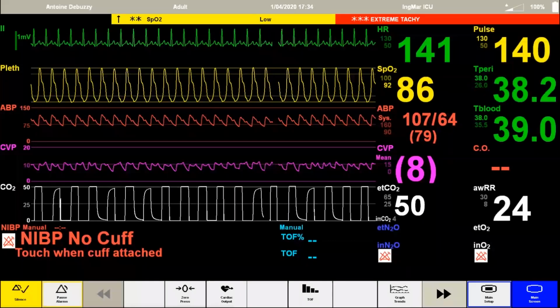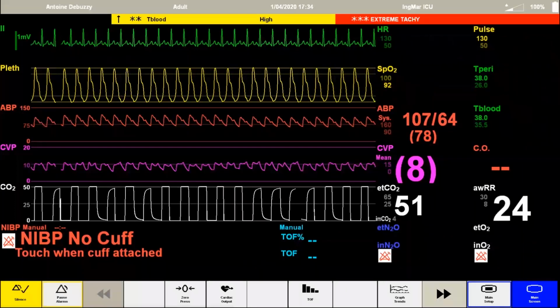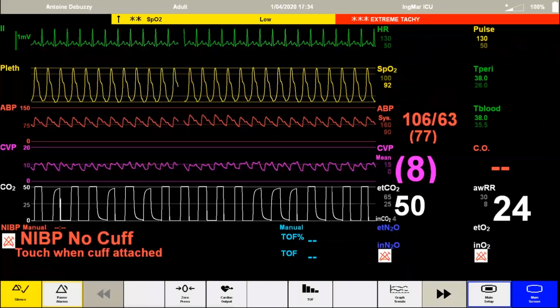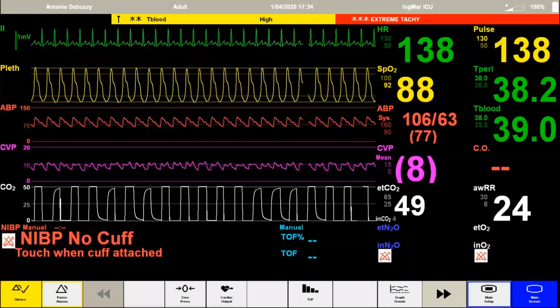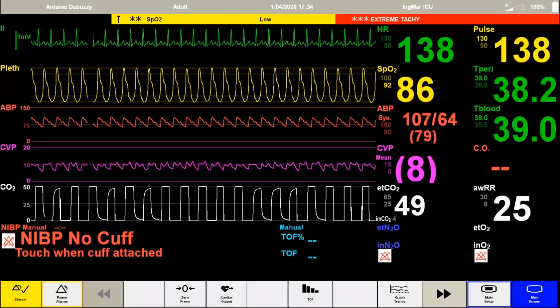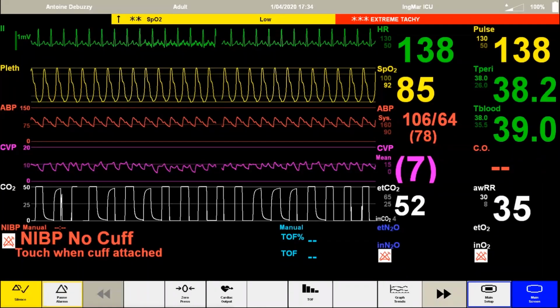As you can see here, we've also built the patient monitor to show the same thing. Initially, there were some spontaneous breaths and we gave some extra medication before the turning process. And as the patient is turned, we've added some extra artifact on the ECG leads, as there will most likely be a lot of touching of the patient during that turning process.